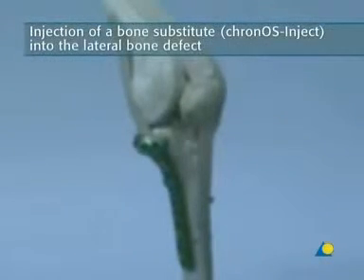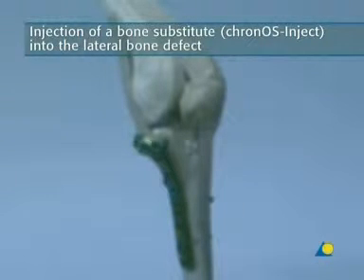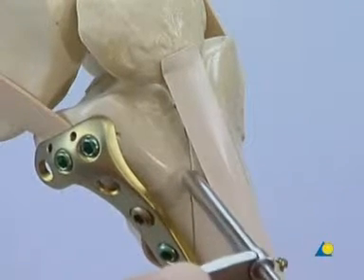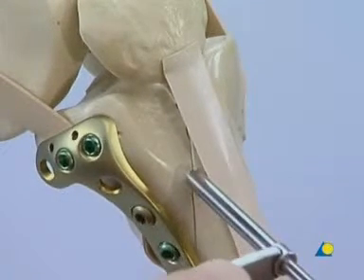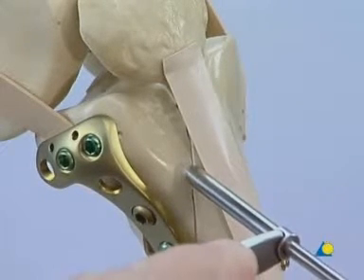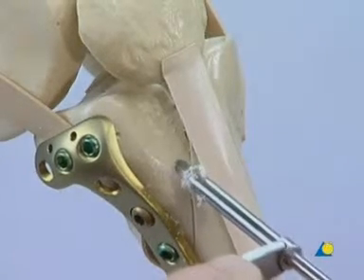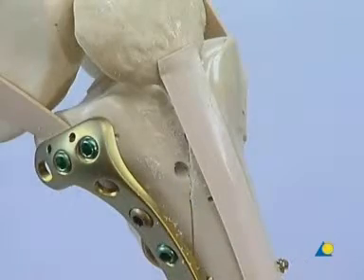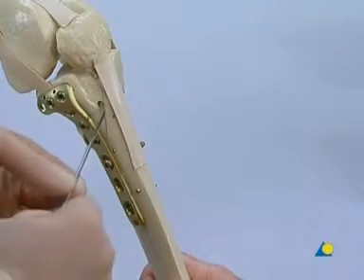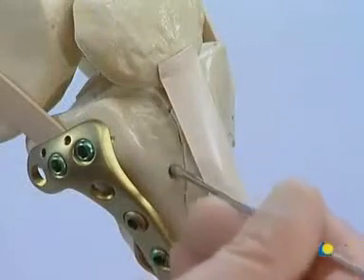Injection of a bone substitute, Kronos inject, into the lateral bone defect. A hole is drilled in the anterior cortex using a 4.5 mm drill. A probe is inserted into the bone defect and used to impact the bone debris to create a single space for the introduction of the Kronos inject.